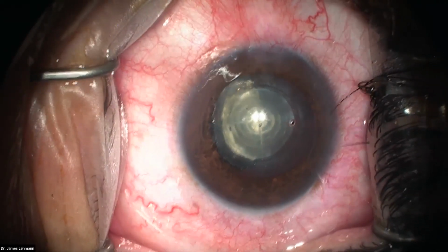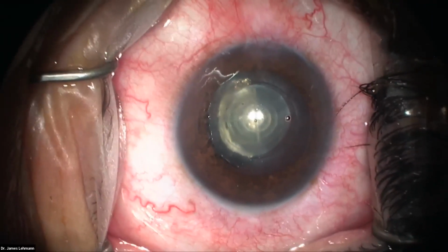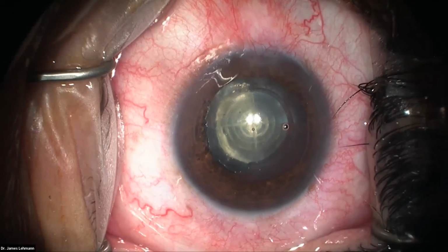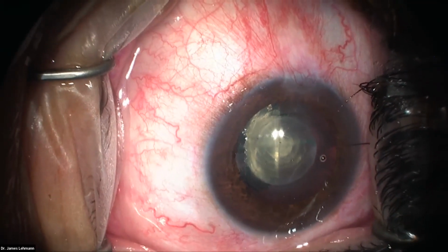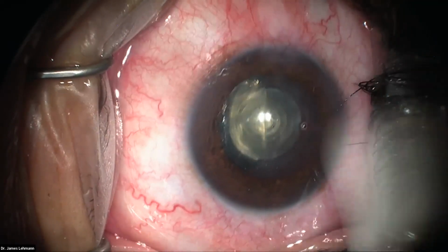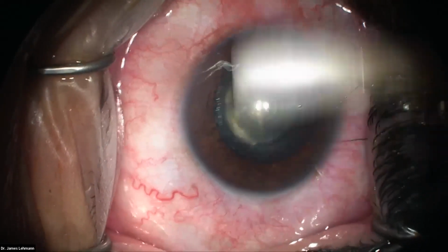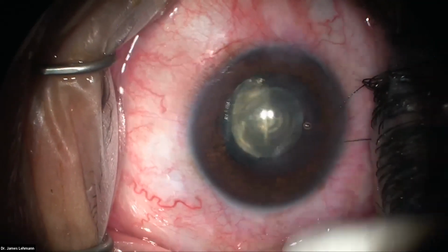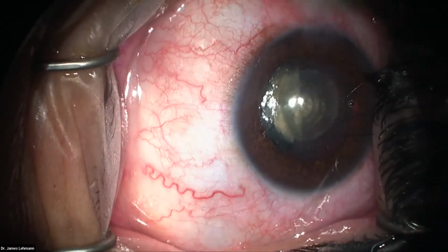So this patient is monocular and has a pretty bad cataract in this eye. He opted to start with the laser, so we have already done the laser fragmentation. I just wanted to show you all this to contrast it with typical cataract surgery and talk about some differences. As you can tell, there's a pattern there, like a target with some cylinders. This allows me to break it up a little easier. You also see a pattern of an air bubble in the back there, so a lot of hydrodissection is already done. It's like a pneumodissection done by the laser, and that makes the next step a little easier. And then on the cornea, there are some arcuate incisions to help with his astigmatism.